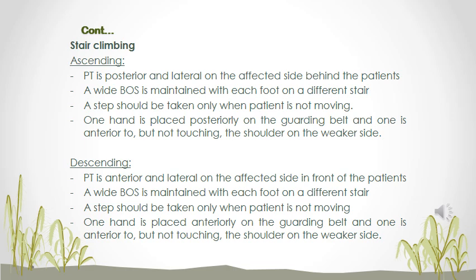A step should be taken only when the patient is not moving. So while they are moving, you're not going to climb up or down. One of your hands should be placed posteriorly on their lower back or on a guarding belt, and one anteriorly, but not touching the shoulder on the weaker side.